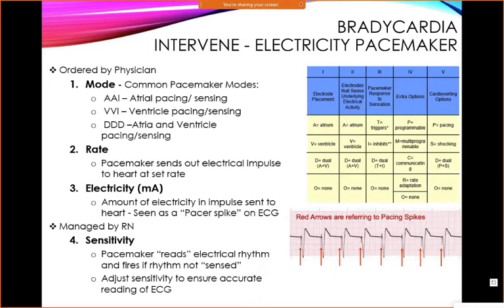Triggers is special. Yeah, the chart says T for triggers. And I will tell you that that is really only used where we are using dual pacemakers, because what it does is it waits. It waits for a certain amount. So if it triggers the atrium, it stimulates the atrium, and then it waits for a few seconds to see if the ventricle goes based on what it told the atrium to do. And if it doesn't, then it triggers a beat from the ventricle. So it's very difficult and complex. Do not stress about that.